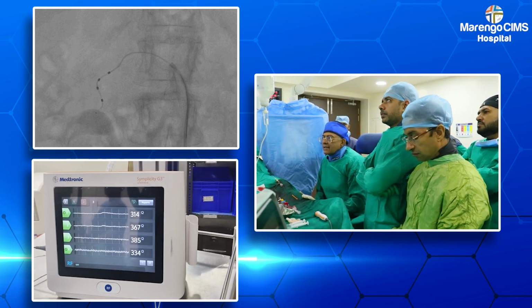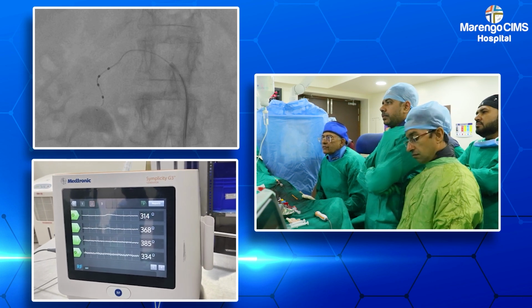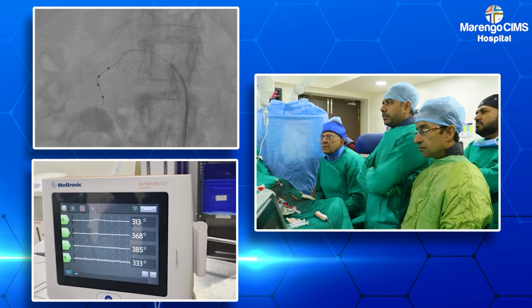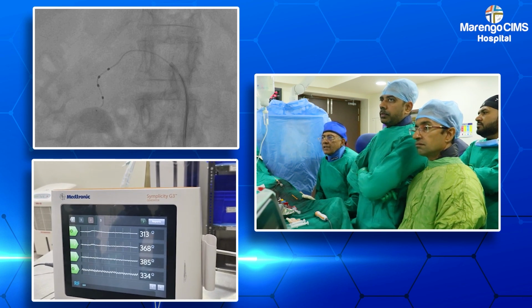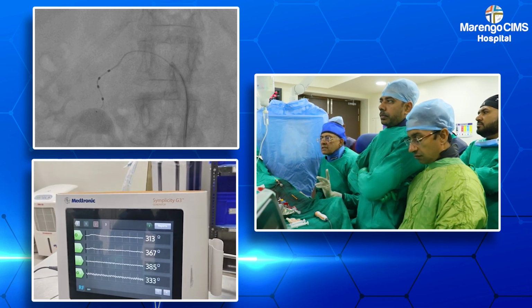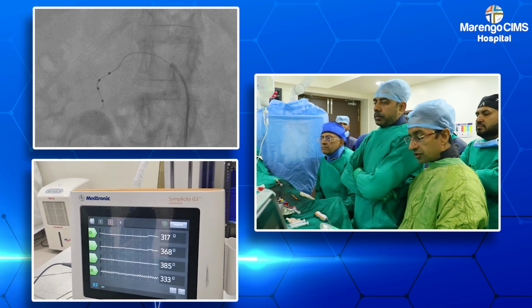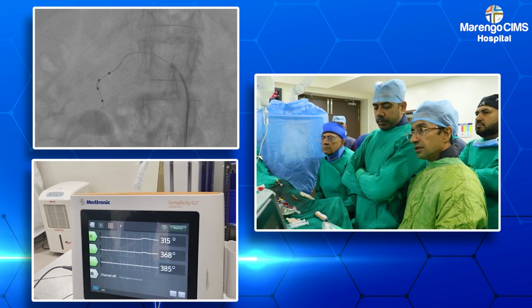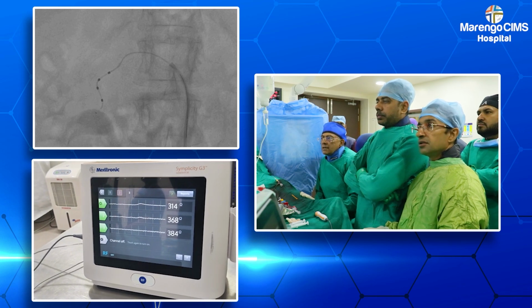So we will start now ablating in the distal 3 electrodes and switch off the 4 electrodes. If you see, the electrode resistance is very adequate for all 4 of them. So Dr. Tejas and Vipul will take over. Right. Please go ahead. So as discussed, I will switch off the 4th channel, which you can see is now done. And now I can start the ablation.